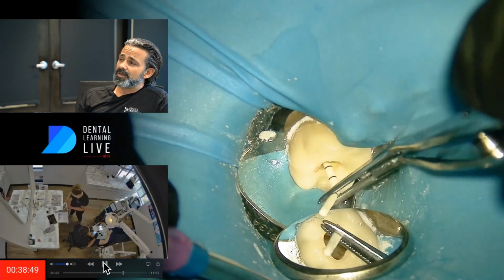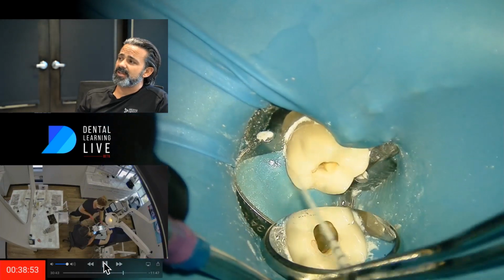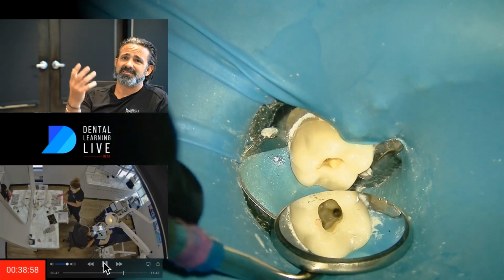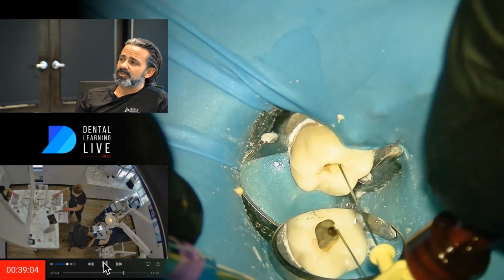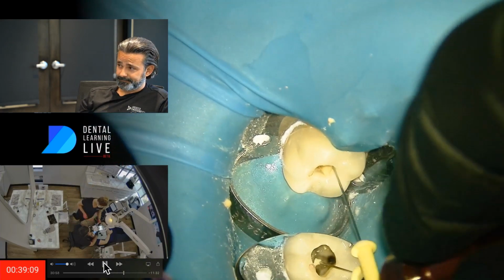And so, fortunately, we don't have much but what we've seen observed along the case. And you'll see me, I'm drying it, just making sure that we don't have any active supporting tissues bleeding into the case so we can get a good seal. And now I'm going to obturate and see if I can answer my questions.